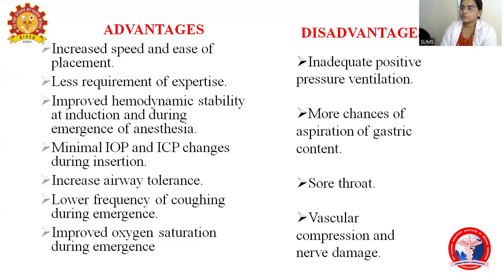Patients may develop sore throat post-operatively, and there may be compression of the vascular structures surrounding the cuff due to continuous pressure, and there may be compression over the nerves also, which may lead to nerve damage.